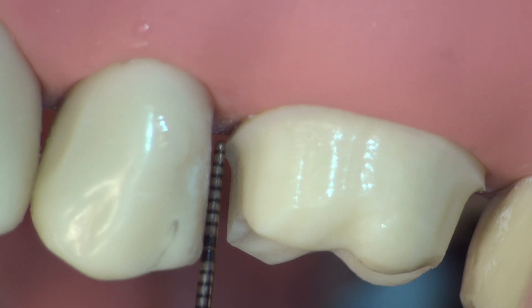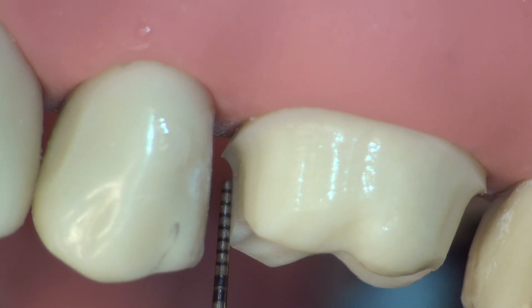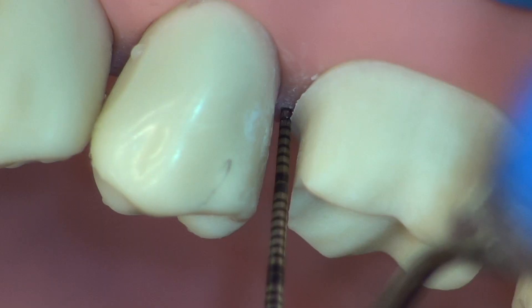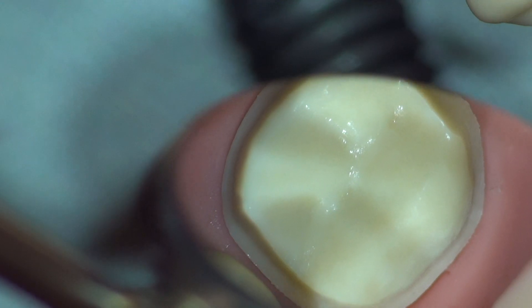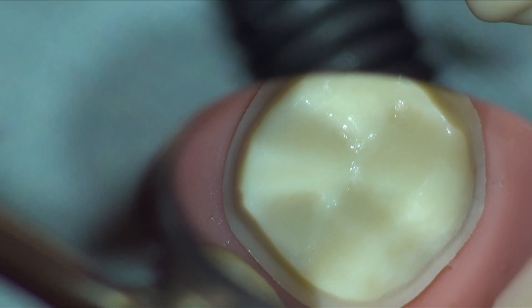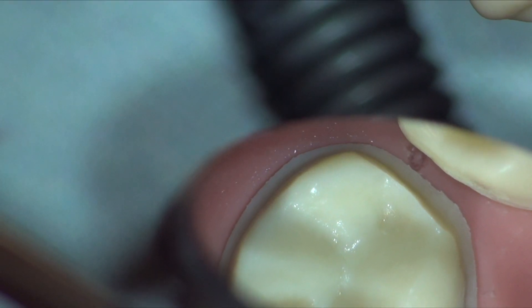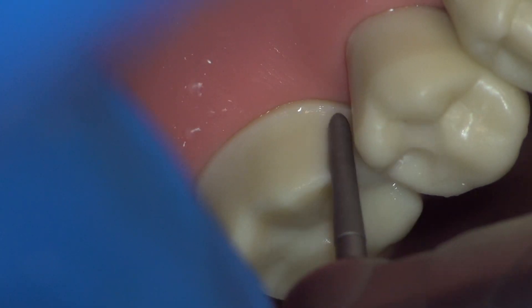Interproximately, we notice the finish line is too supragingival. From this view, we can also appreciate that the contour of the axial wall is exactly that of half of the chamfer burr. We correct the finish line position to 0.5 mm supragingival and confirm. It is essential to evaluate your axial reduction circumferentially from the occlusal view using a mirror. With this view, we can immediately see thin areas of our finish line — in this case the mesiolingual and distal lingual areas. We correct those sharp line angles in the same smoothing manner.